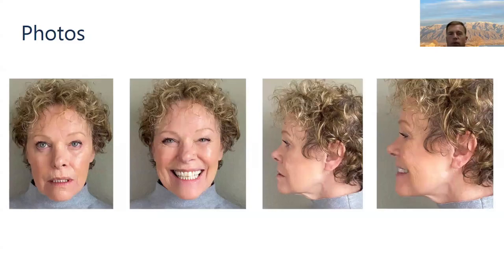So we'll talk about photos first. Again, if you're doing 3D facial scans, that's awesome. Take 3D facial scans with a variety of different lip positions so that we can evaluate our design against those. If your patient wears a denture, we'll talk about this in a little bit, you need to do an impression reline inside the denture to make sure it's stable, but you'll want that done before you get the photos, so that way the denture is not flopping around, and you'll have a reliable position.